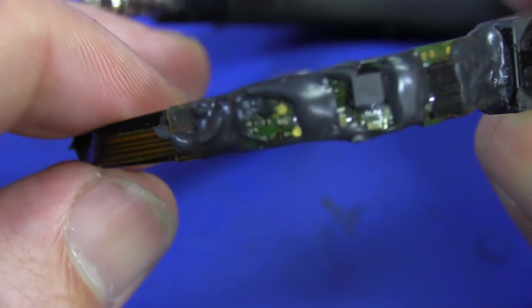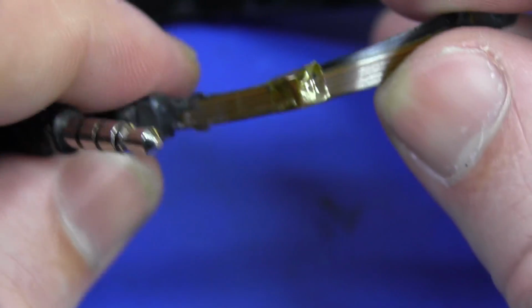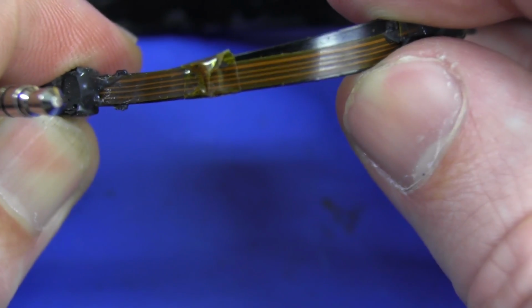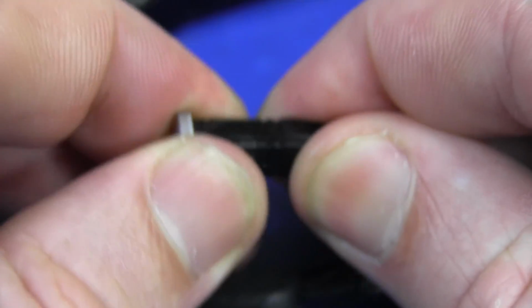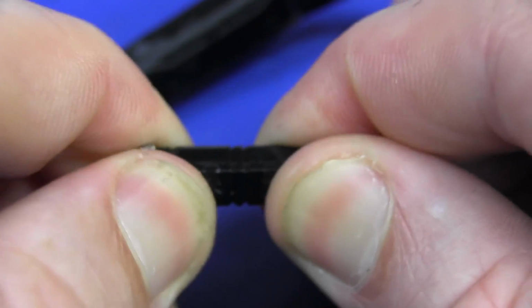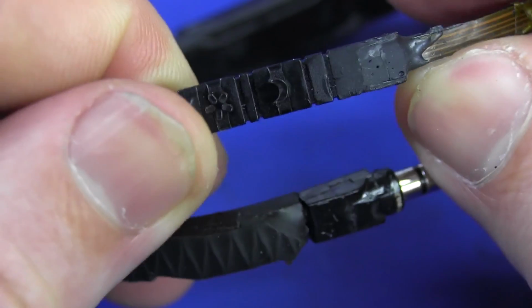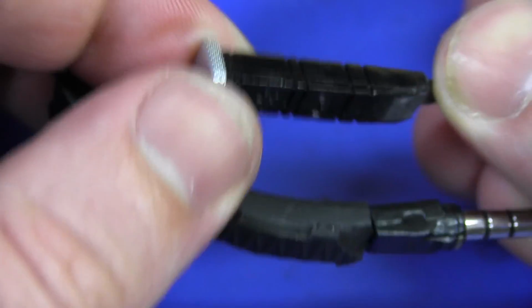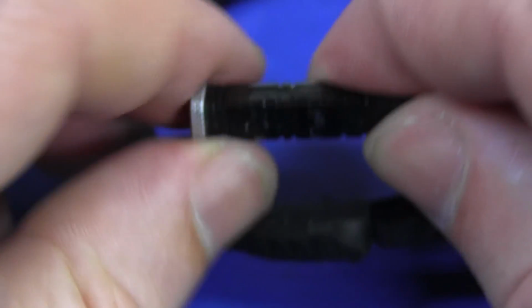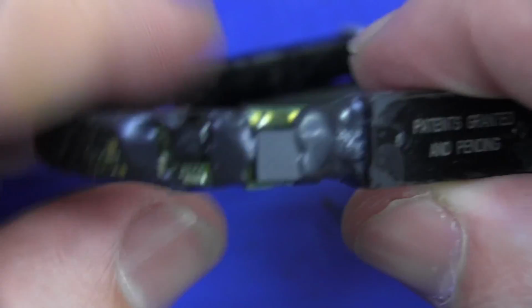I'm not sure. The gunk in there is really rather annoying, and they've got, you know what, 4 traces leading around to this over here, and I have no idea what that end piece is. Is there another accelerometer in there, maybe getting a different reference point or something like that? So I'm not sure what actually is inside that thing.